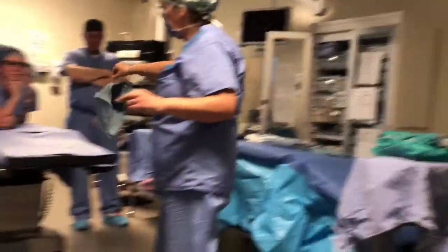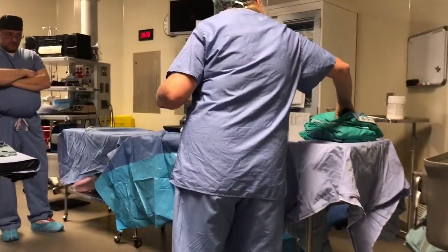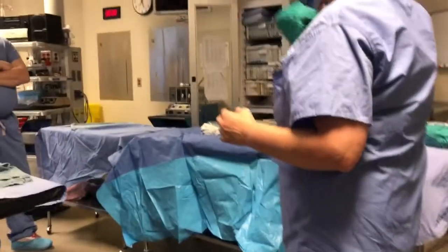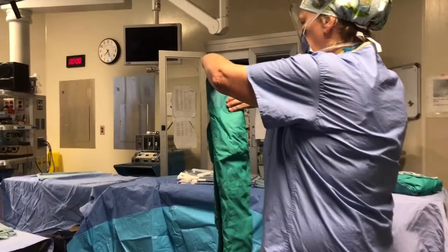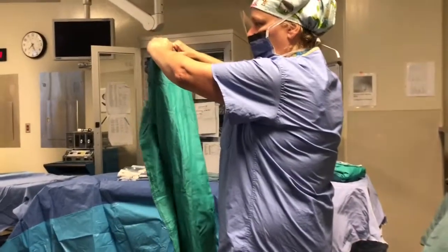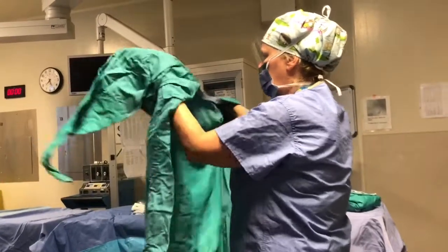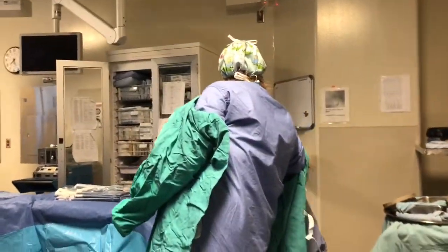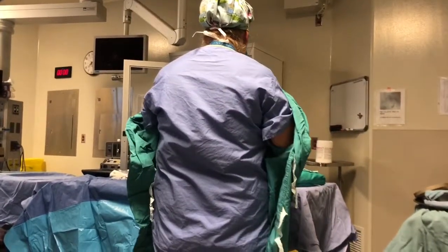You're going to throw it off. You're using the outer guard, right? You're going to pick up this gown so that you pick it up like this, right? Instead of dragging it across. And then you let it down. Hands across the neck, and then you can fold your hands in. Put them on the right side. Somebody doing that?